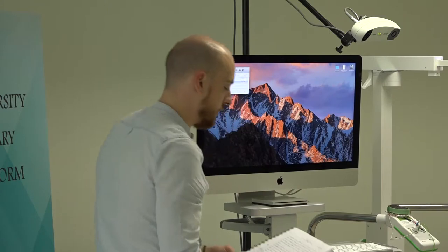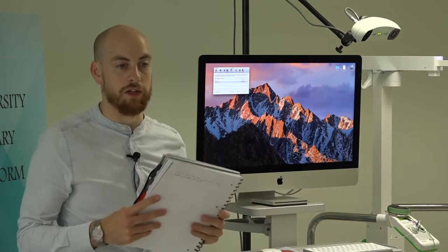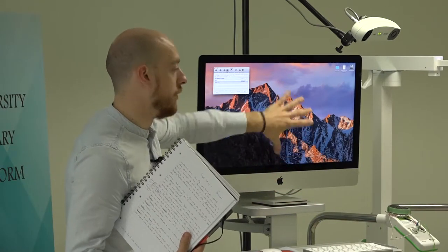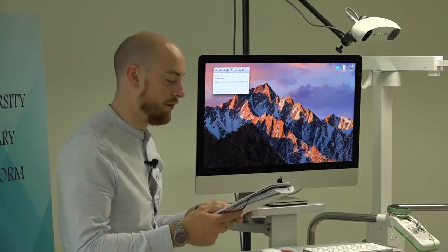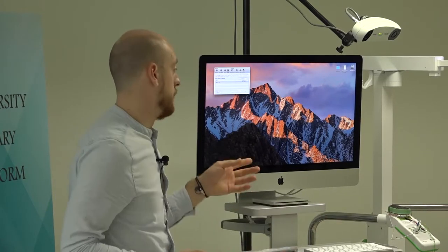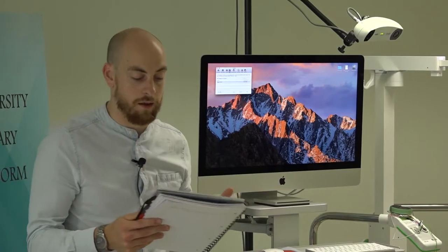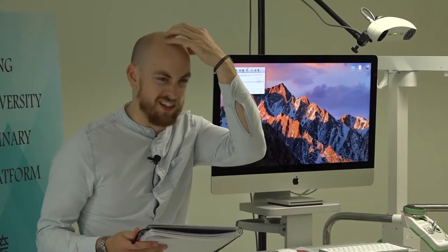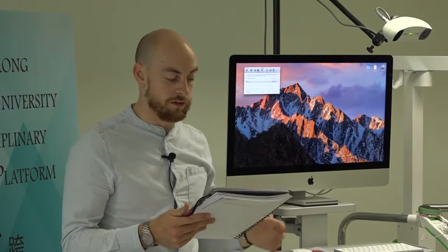Next thing to do is a reconstruction. The reconstruction part isn't necessary when you're using the MNI head project that's already uploaded, which I'll run through after doing our own data, because it's already been set. But with a new MRI, it gives the user 3D reconstructions of the skin, the curvilinear brain with the gyrus and sulci, so you can see all the unique structures within the brain, and the brain surface.